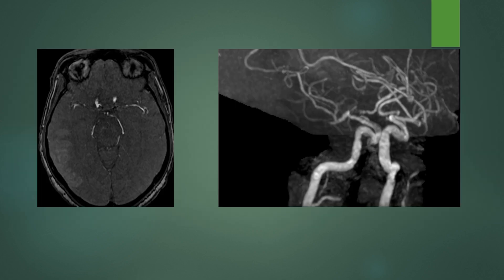On vascular imaging, you want to see where the MCA is occluded or narrowed. On the axial source images, follow the M1 segments to the bifurcation or trifurcation within the sylvian fissure. In this case, there is bifurcation on the left; on the right you see two branches, but one ends. On the MIP images, there is an abrupt cutoff of a right M2 branch, specifically the posterior branch.